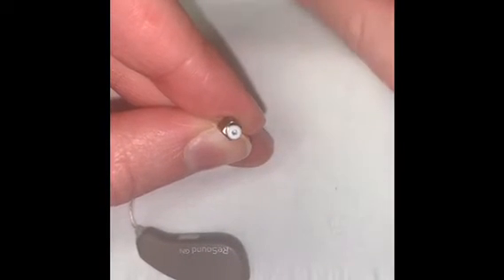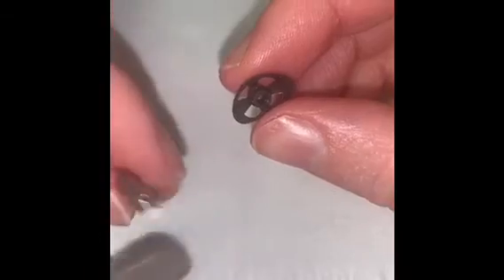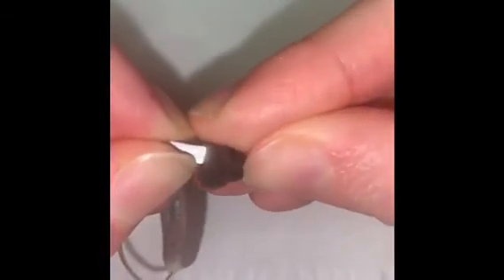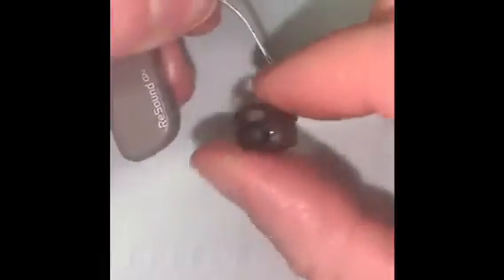Once that is done you can put your dome back on. You'll be looking for the center hole right in the middle there and you want to match that up with the tip of your receiver, and you want to make sure that it's secure — and that's it.